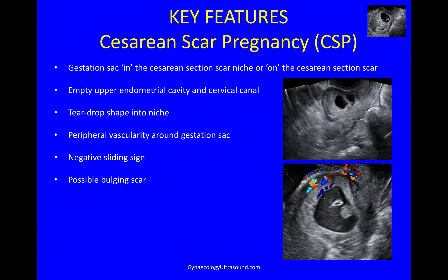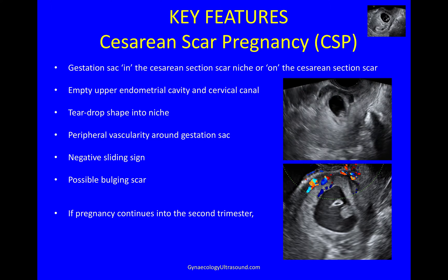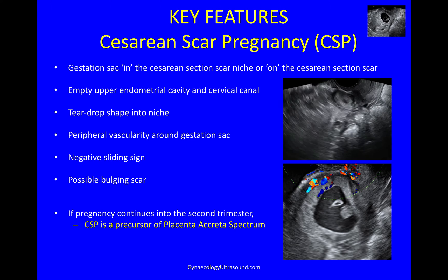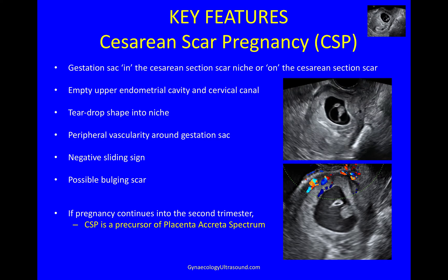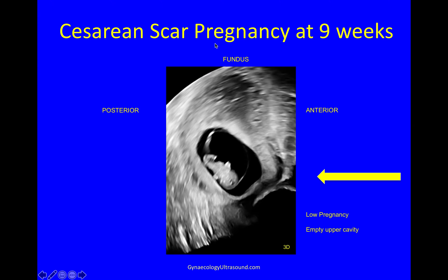Sometimes you see bulging and that is an important thing to look out for. 3D can be useful here because if the pregnancy continues into the second trimester, a scar pregnancy is a precursor of placenta accreta spectrum. On 3D you can see the fundus at the top, the anterior wall, and the pregnancy embedded low in the uterus with the upper cavity empty and the lower section bulging slightly. You can also see the placenta embedded in the scar and a very eccentric insertion of the umbilical cord.